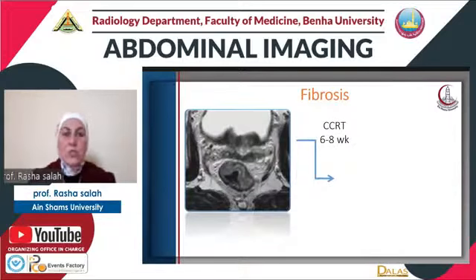Let's see how this works. When the patient has performed the concurrent chemoradiotherapy, we should delay the assessment of the treatment for about 6 to 8 weeks to allow the inflammatory process occurring after radiation therapy to subside, and allow the rectal wall edema and swelling to subside, to help in discrimination of the post-treatment changes and the true residual viable tumor.